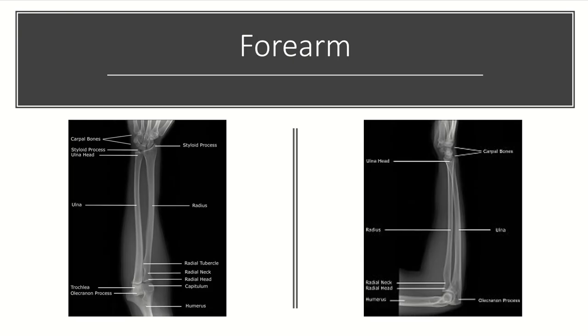The forearm is typically a two-view series, an AP and a lateral. On the AP, we want to see that the radial styloid is 180 degrees from the biceps tuberosity or radial tubercle. And on the lateral film, we want to see that the ulnar styloid is 180 degrees from the coronoid. This is a pretty good AP and lateral of the forearm.